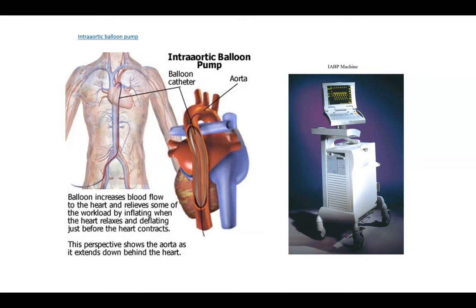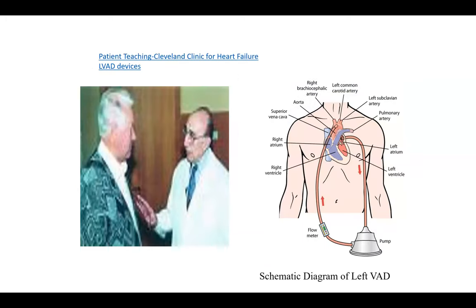So you just measure it, get the patient sterile, because you can't bring a fluoro machine into the ICU or the coronary care unit. So just measure it and take that length and you implant it. I remember what we did a lot when I was still training in India. Then you set it up.